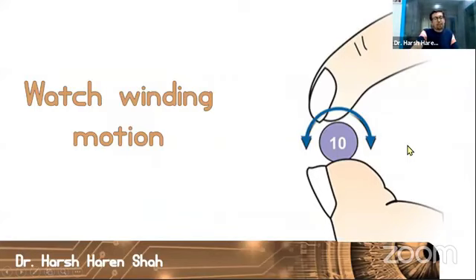So talking about glide path, before we actually delve into the details of how glide path is prepared, there is one basic endodontic motion that needs to be revised at this point of time. That is the watch winding motion. I've seen a lot of clinicians not being aware about how precisely watch winding motion has to be done. You can log into YouTube. There are ample videos there. You can read Grossman, a book as basic as Grossman has also explained the procedure very well.